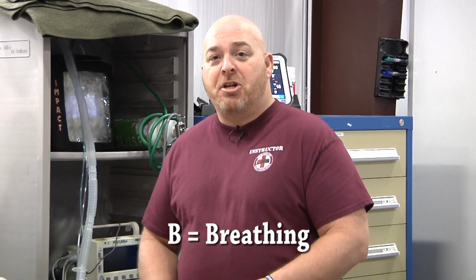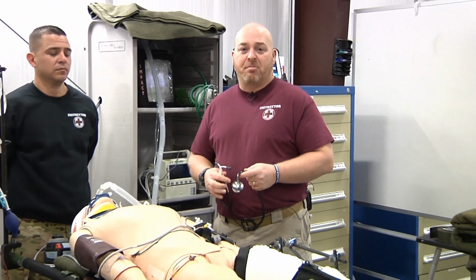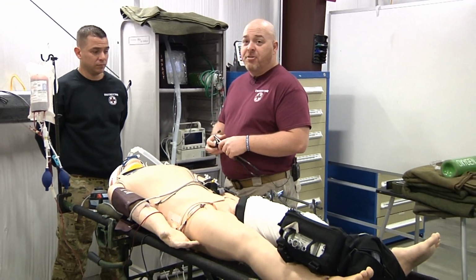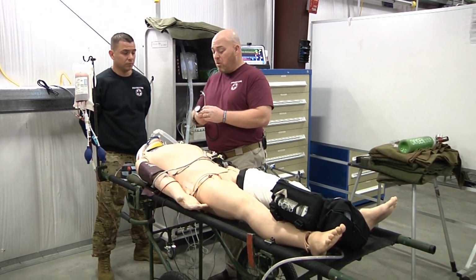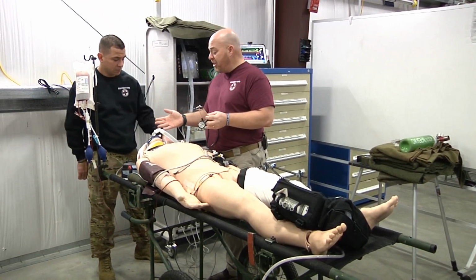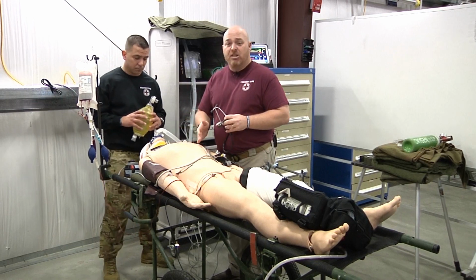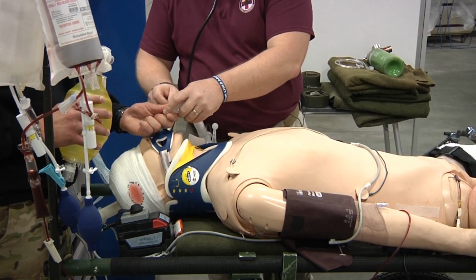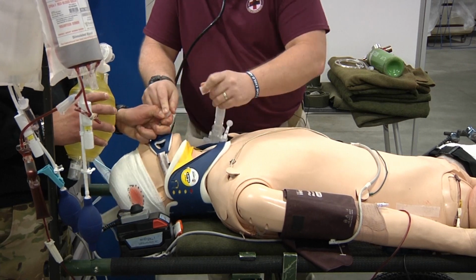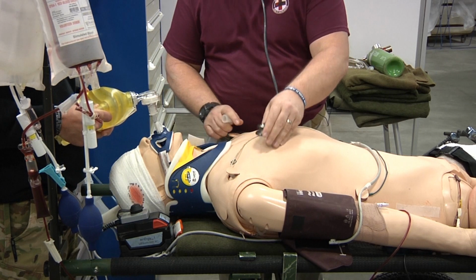This is a great opportunity for you to take the time to do a true assessment of your patient's breathing. In the aircraft, you're not going to have the ability to use tools like a stethoscope. So now what we're going to do is my partner is going to check lung compliance, and I'm going to take an opportunity to auscultate breath sounds. We're going to remove the patient from the vent. My partner is going to bag the patient on oxygen.